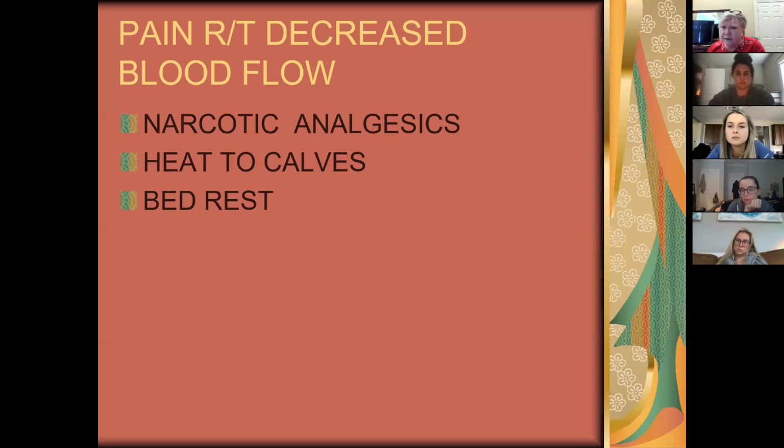I'd have to look again because I don't teach fundamentals and I'm not exactly sure what each liter takes you. It's either 2 or 4. I'm not sure. But we've got him at 28, maybe closer to 30, probably 28%, I would guess, 26 to 28-ish at 2 liters, from 21 to 26 to maybe 28. Okay.